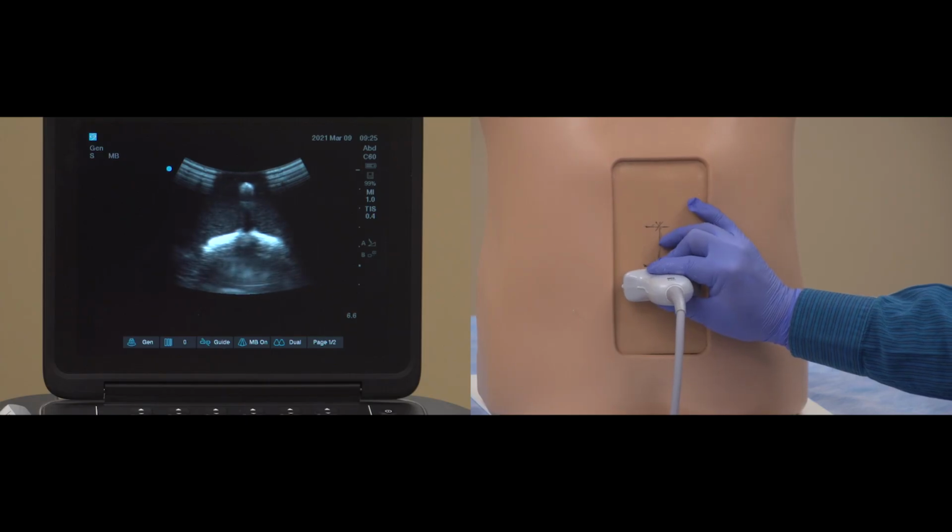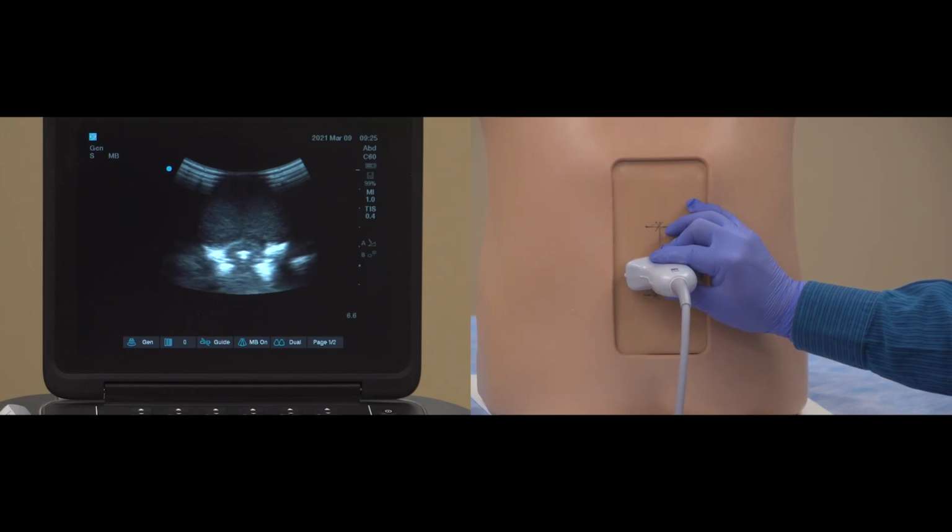First, placing the probe in a transverse orientation centered over the L4, L5 interspace at midline, you will be looking between vertebral bodies and anticipate seeing the ring of the spinal canal created by the ligamentum flavum nearest the probe, the posterior vertebral body, deep, and the articular processes on either side. Freeze this image and again use the calipers to measure the depth from the skin surface to the ligamentum flavum.